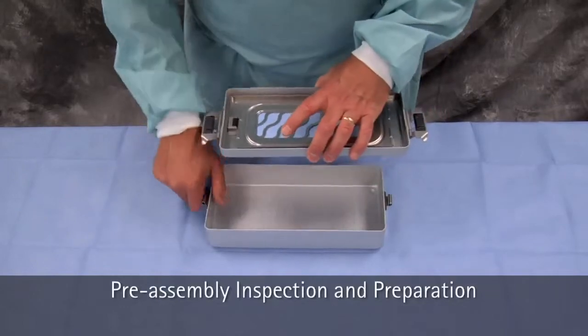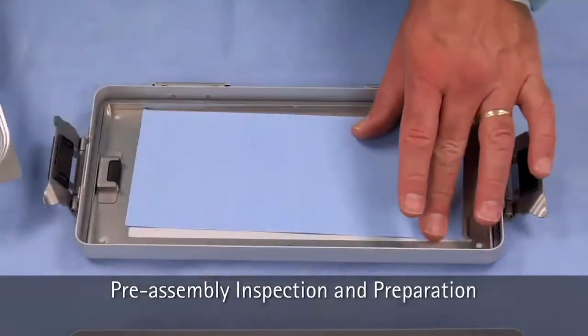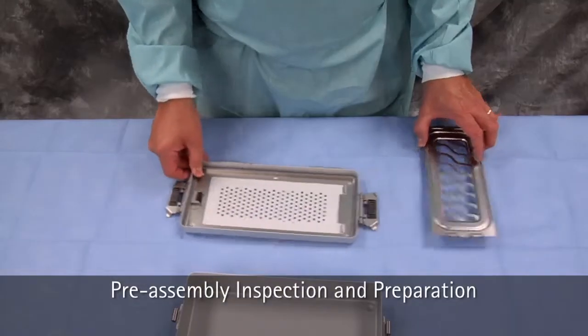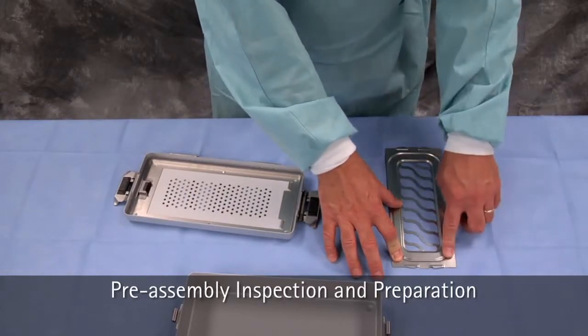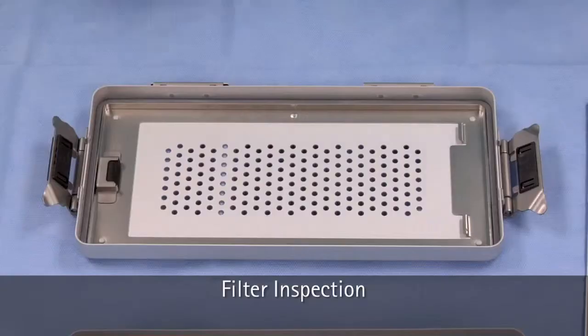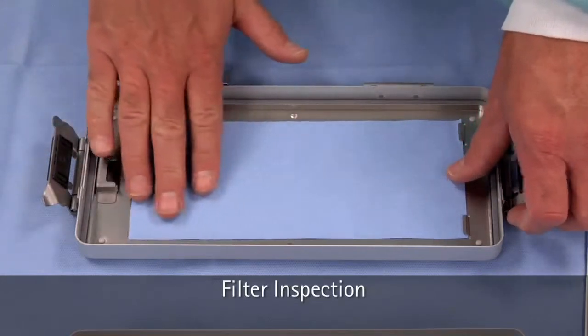Next, remove the filter retention plate on the lid and discard the filter if present. Place the filter retainer on a flat surface to check for continuous contact around the edge. Repeat these steps if using a perforated bottom container. Place a single-use filter into position.